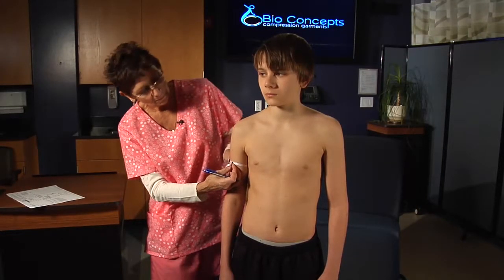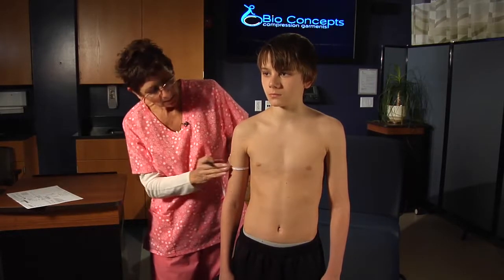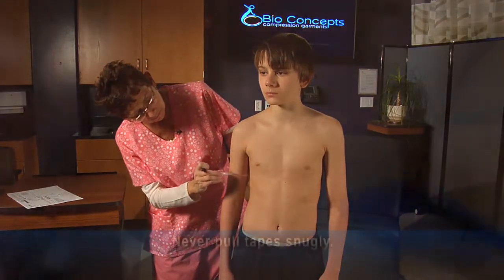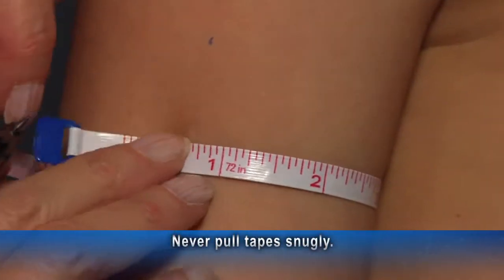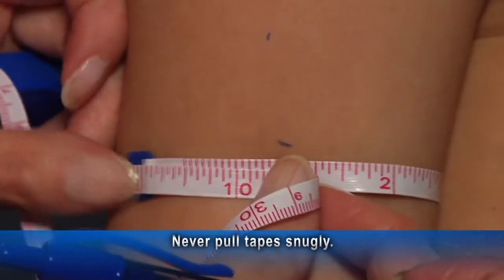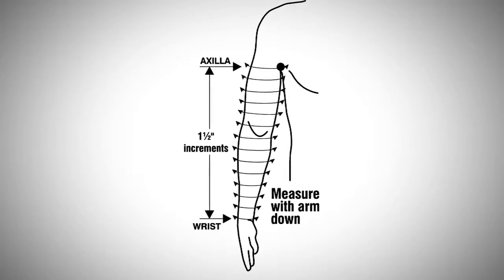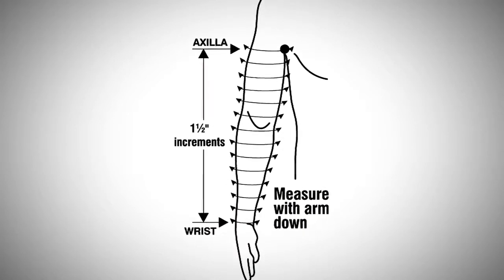When measuring for upper extremity garments, it is important that the patients have their arms relaxed at their sides in a neutral position. Use BioConcepts retractable tape for circumference measurements, and remember, never pull the tapes snugly. You can start these measurements from the wrist and work up, or from the axilla and work down.